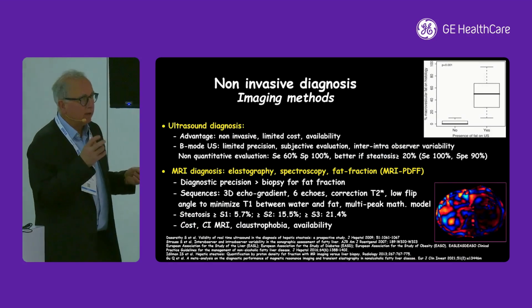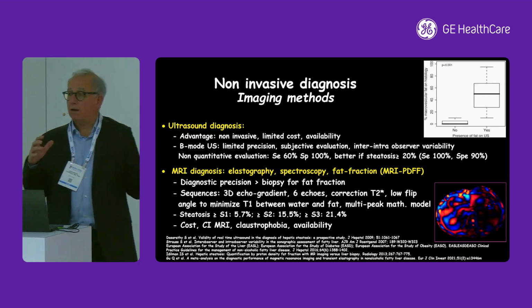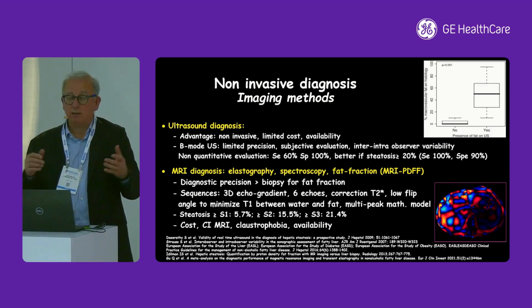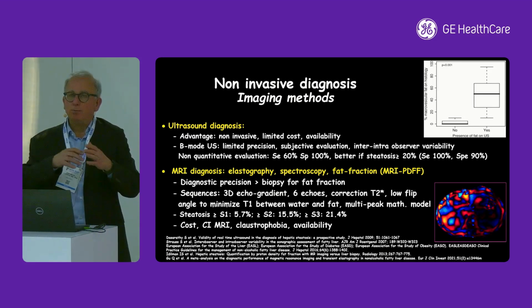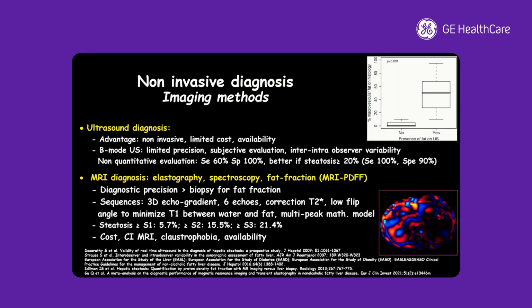Just with the eye, you're doing a great job in separating the normal liver from the steatotic livers. But I will show you the numbers in a study that we published recently: by eye, you're not able to stage the disease. I mean, to separate moderate steatosis from severe steatosis. So the eye is doing a pretty good job, and MR is our reference. Mainly, MR is the reference for MR-PDFF measurements.